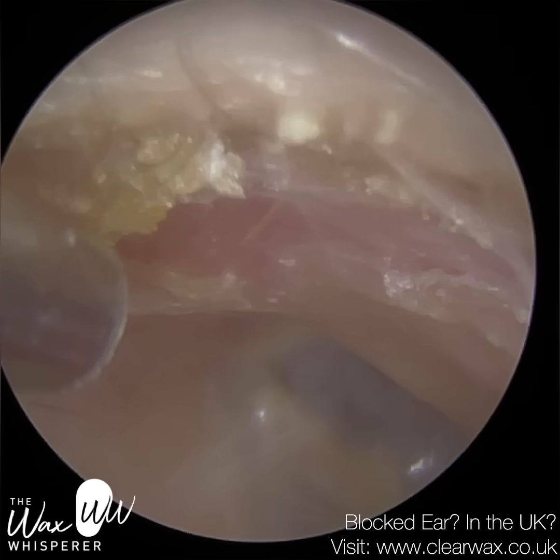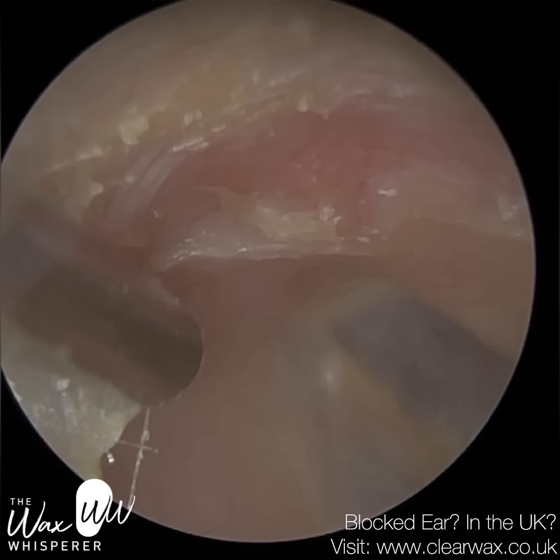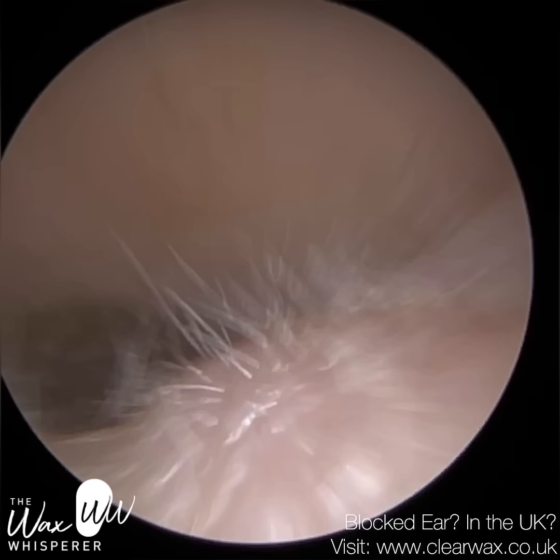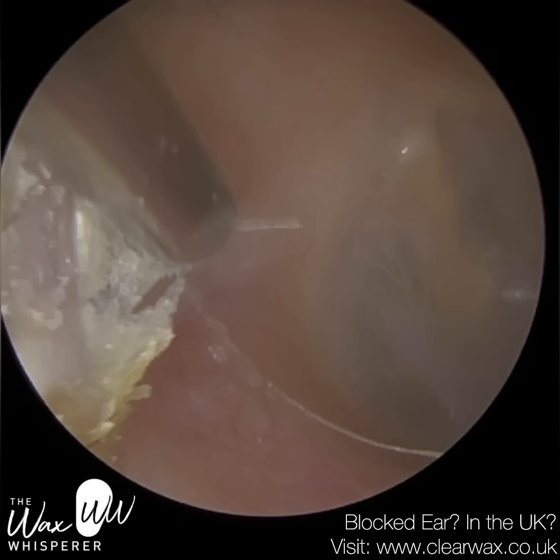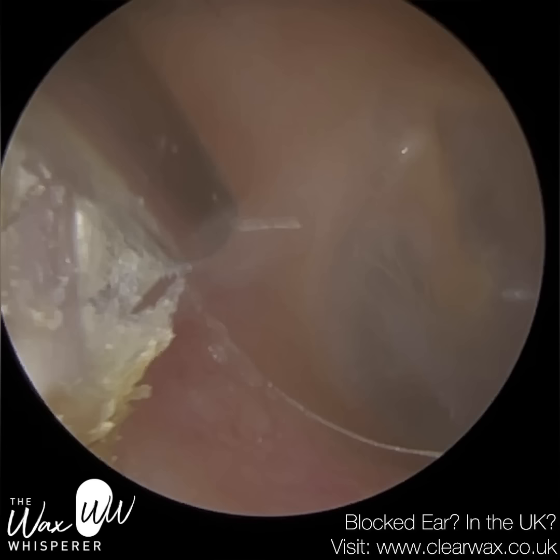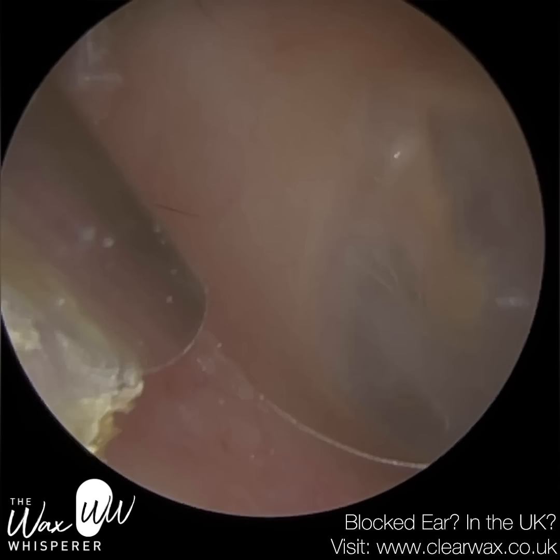I'm just mopping up some dead skin around the edge here. A lot of this dead skin is on the boundary of what we call the osseo-cartilaginous junction. You can subdivide your ear canal into thirds: the outer third is made up of cartilage, and the inner two thirds are made up of bone. And this skin that I'm removing is right at that osseo-cartilaginous junction. In some patients, you can actually visibly see the boundary, because the bony part of the ear canal is typically more red and glossy, while the cartilage portion is more dull and matte in appearance.